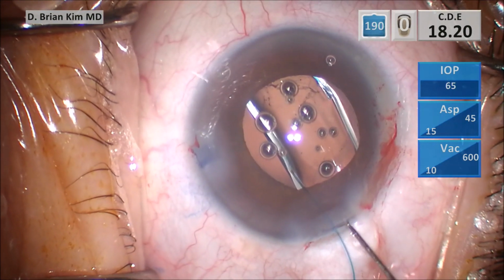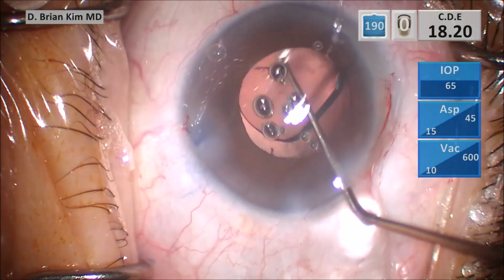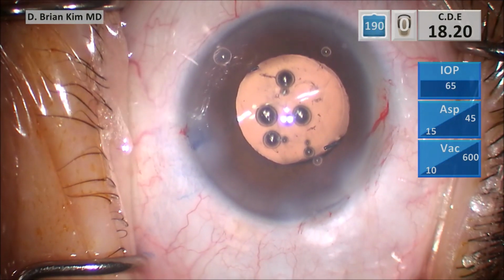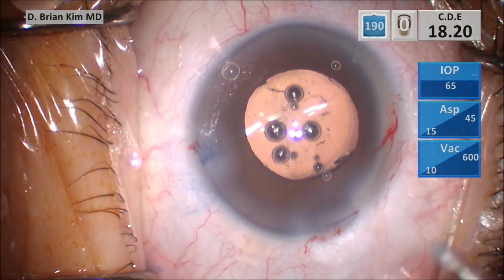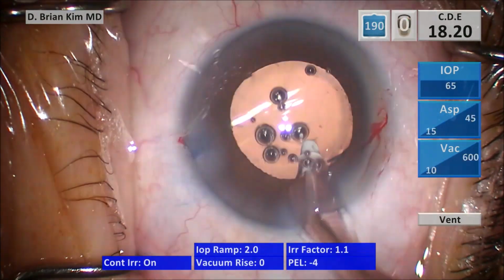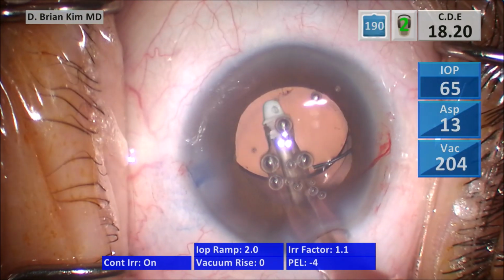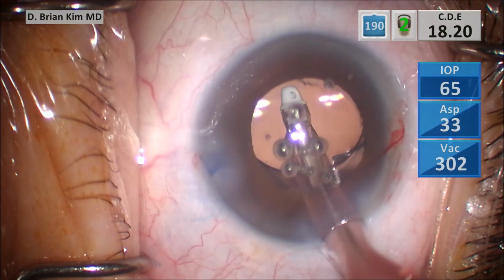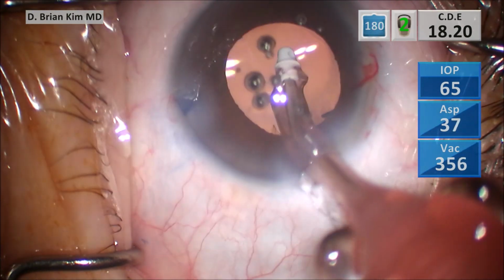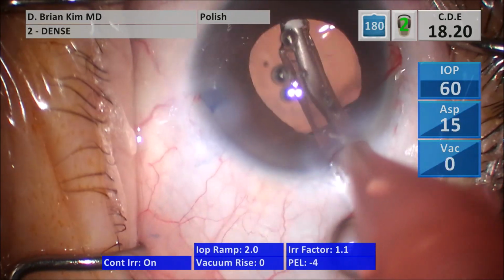So again, if you have cases of corneal edema that are flabbergasting and perplexing you, think about it. It means your corneal endothelium is being damaged. You're not coating the corneal endothelium well enough, or more likely you're removing the viscoelastic unbeknownst to you due to high vacuum. So I go underneath the lens, removing all the viscoelastic from within the bag. I'm going to polish underneath the rhexis edge. You can see I've left all those bubbles there.